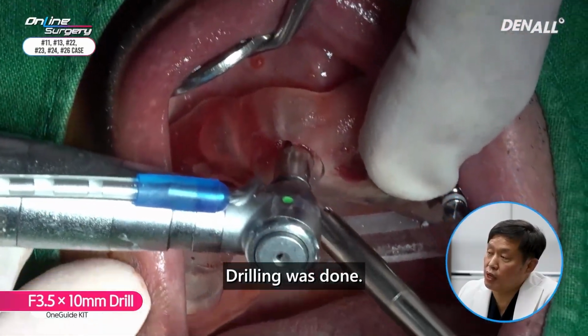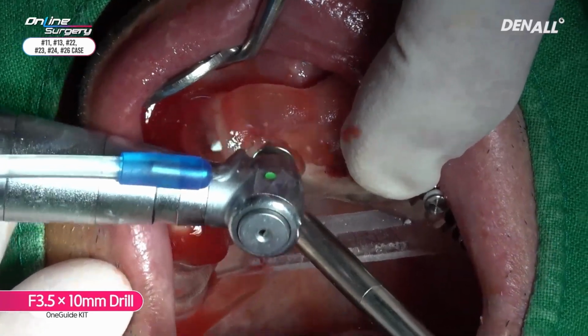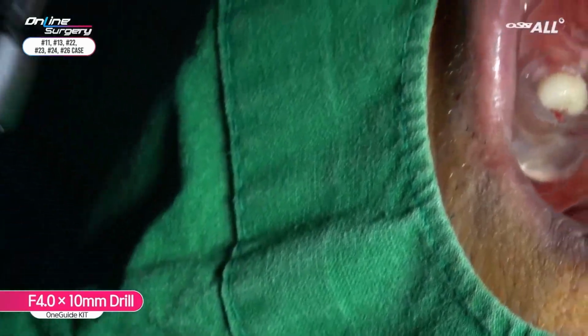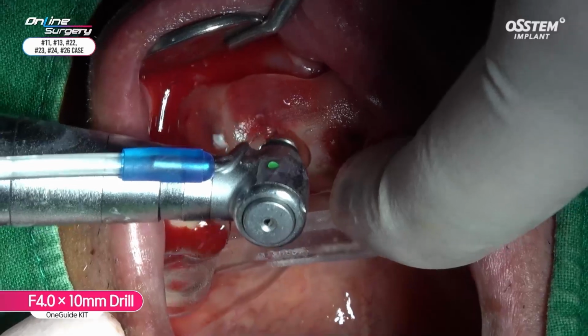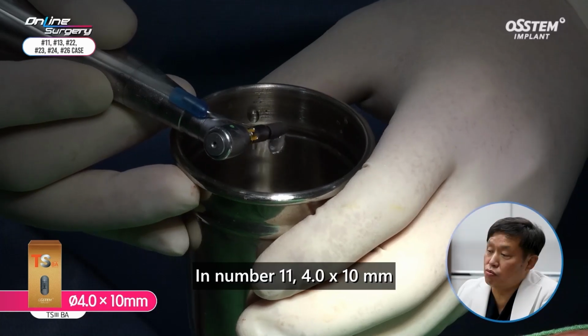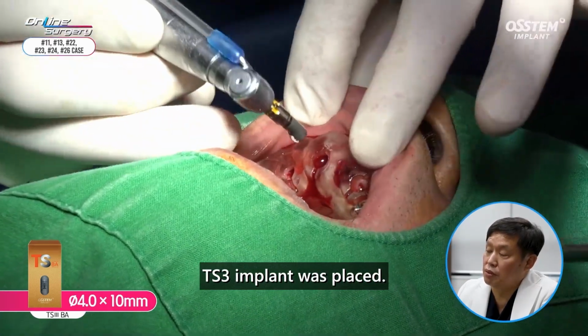Drilling was done. In number 11, 4.0 by 10 mm TS3 implant was placed.